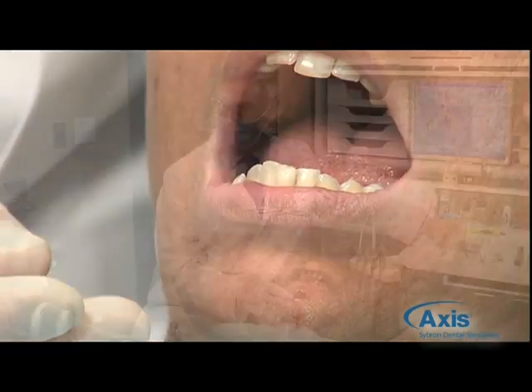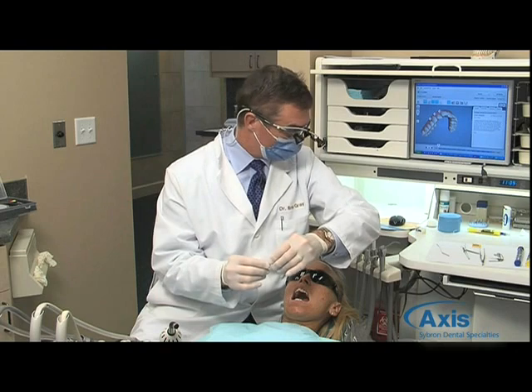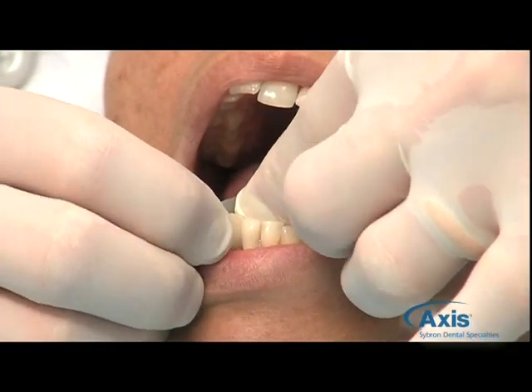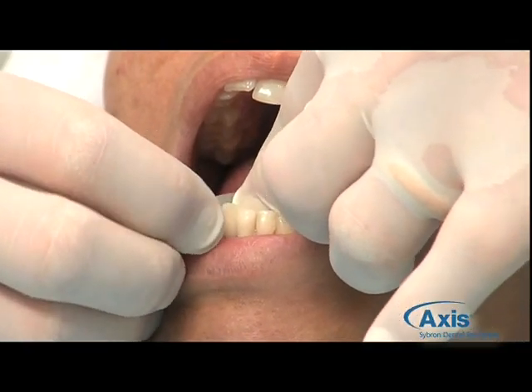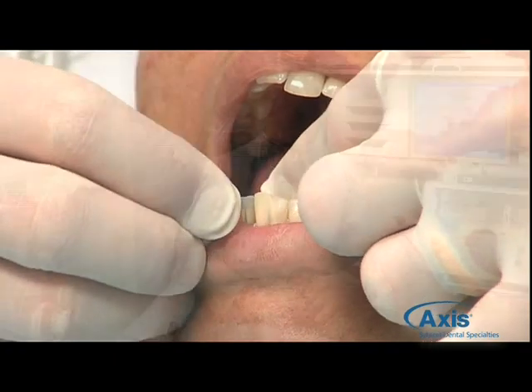Now we'll go back to the red strip and we'll fold it over, making it 0.1 plus 0.1 millimeters, or 0.2 total. And we'll slide that between the teeth. And this, I'm going to come in from this angle, working that along the sides.